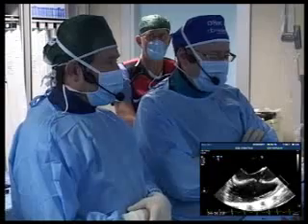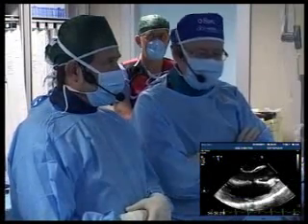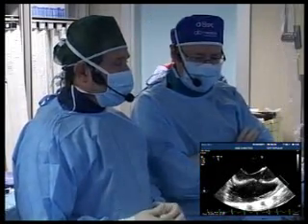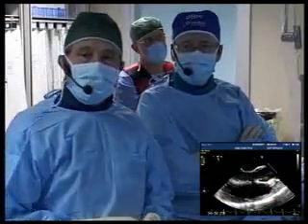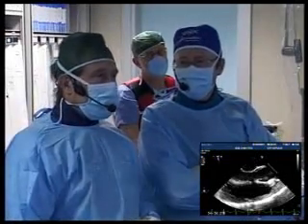Okay, that's an interesting one. Gerald? Well, I have not that much experience with closing VSDs, but I would rather go for a smaller than a larger device in regard to the conduction system. Eight muscular? Well, the choices are 8, 10, and 12.